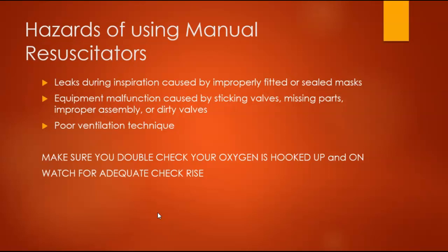This has happened to me a good 10 times where I've walked in and we're coding the patient and the bag isn't on the oxygen or isn't turned on. So definitely this is something good practice to just double check that every single time.